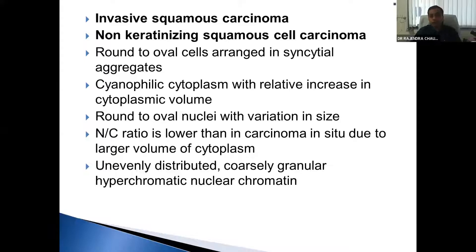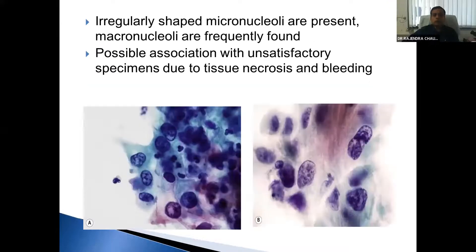The next category is invasive squamous cell carcinoma. The first type is non-keratinizing squamous cell carcinoma: cells are round to oval, arranged in syncytial aggregates, with cyanophilic cytoplasm. The NC ratio is comparatively decreased due to the relative increase in cytoplasmic volume — a change from CIN. The nuclei are round to oval with variation in size. Chromatin distribution is uneven, coarsely granular, and the nuclei are hyperchromatic. The chromatin is irregularly dispersed and micronucleoli can be seen, along with chromatin clumping.